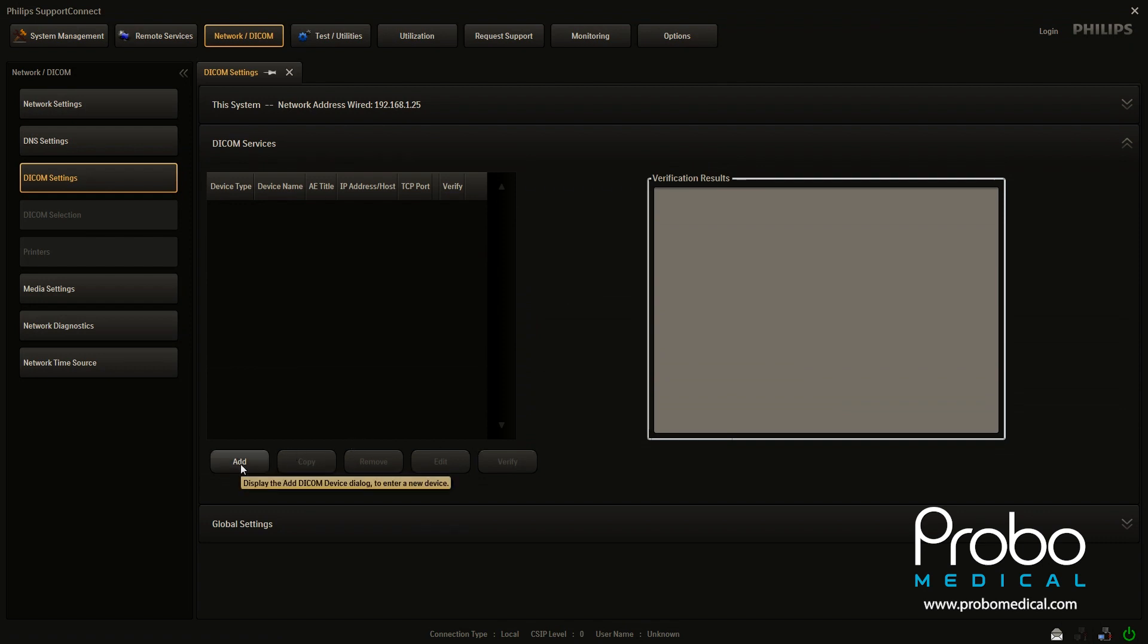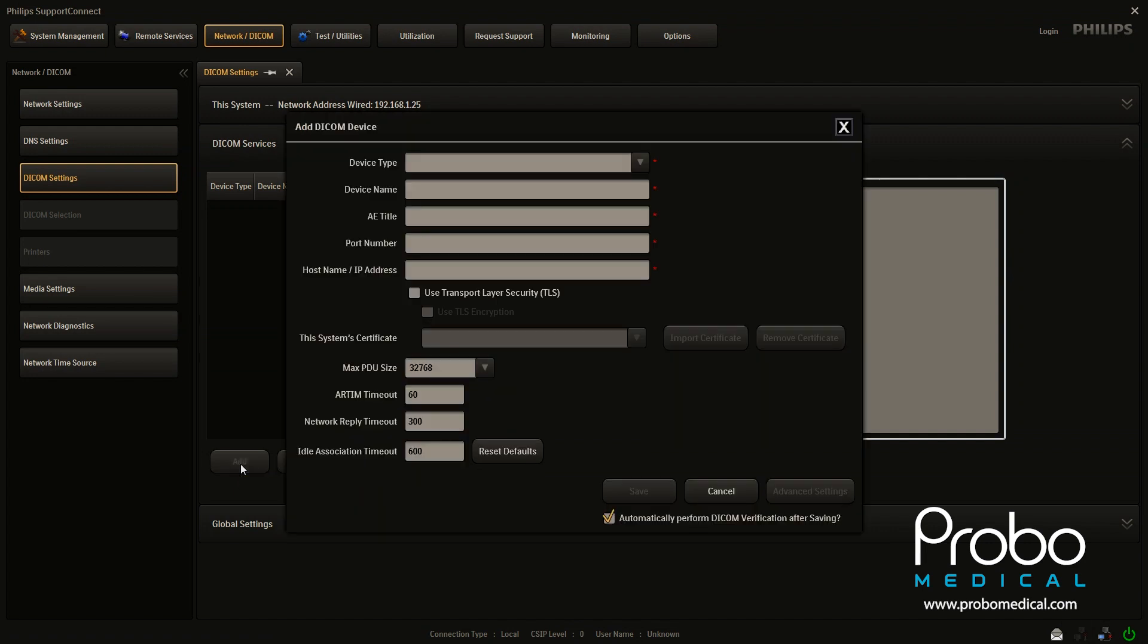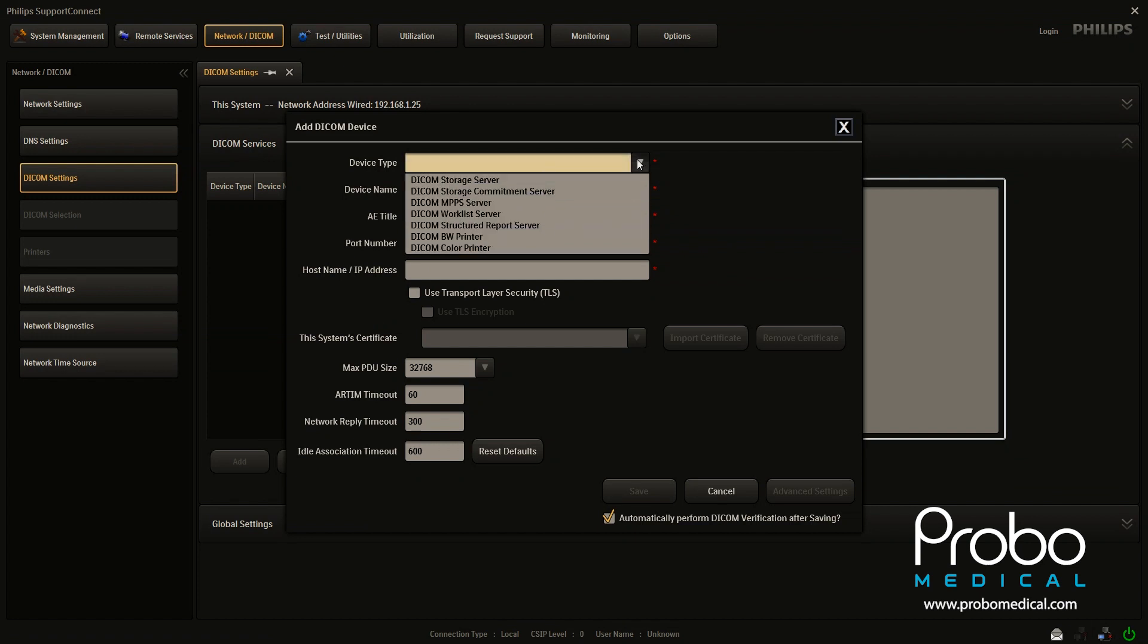But if you're adding a worklist, it's really the same process. It doesn't matter which type of device you're going to enter. But that's what we're going to start with first is the DICOM device type. So come up here and we're going to click DICOM storage server. But you can see here there's worklist server and a few others.